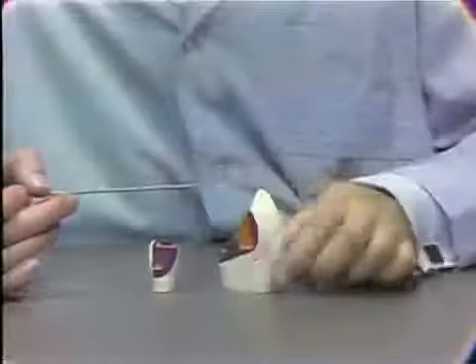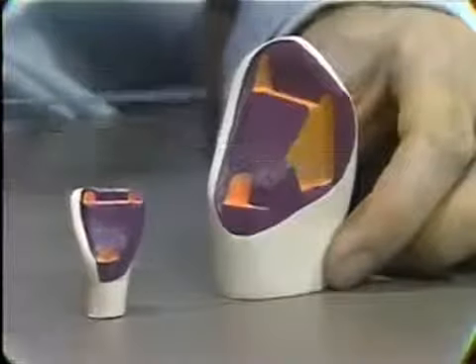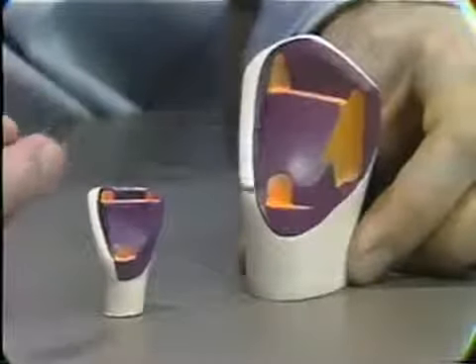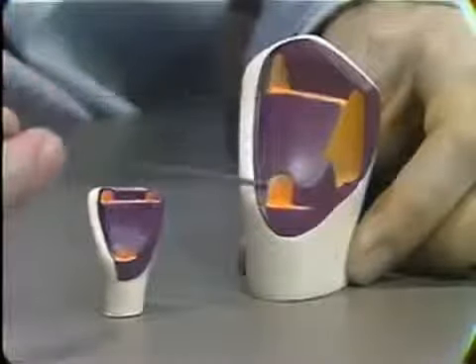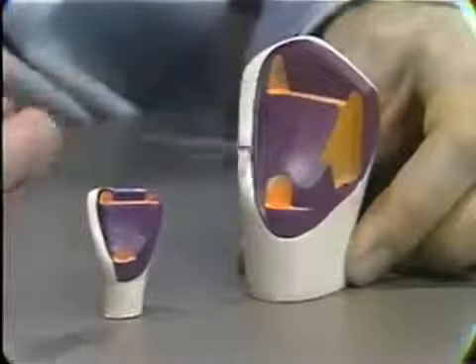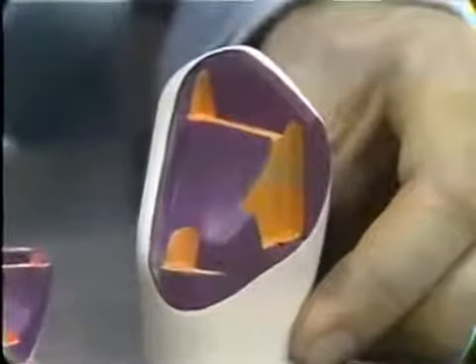Here is a pin ledge preparation on a mandibular cuspid tooth, one in which the box type of retention has been placed on the proximal with two pins in this situation. Notice here the groove which runs down the mesial surface of a unilateral pin ledge to give here an adequate bulk of gold, which compares to the bulk of gold in the slice area on this side, so that we get a quadrangle of gold here from which the retentive devices originate, to give rigidity and strength to the preparation.